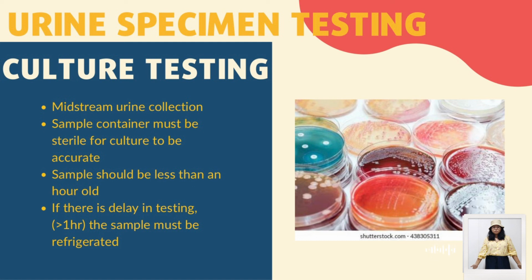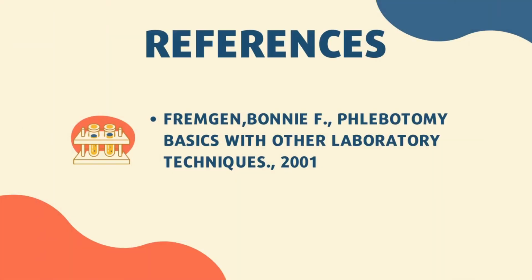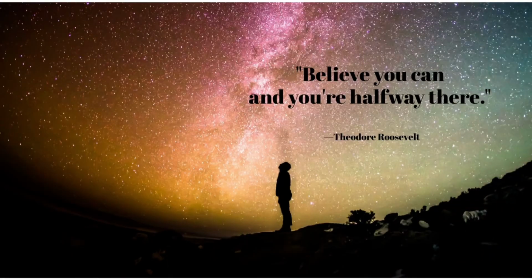In this test, the sample should not be kept longer than 1 hour because if it is kept longer than that, the bacteria in the sample may multiply and could affect the test result. If this happens, or if there is a delay in the testing, the sample must be refrigerated to preserve the sample culture accurately. So that ends our discussion for today.